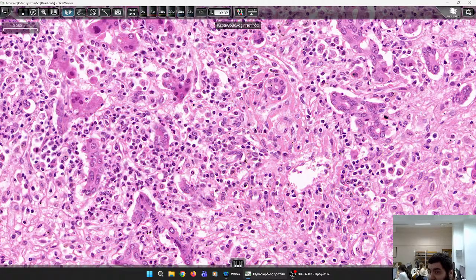What causes this? The most common would be autoimmune hepatitis and acetaminophen toxicity. And some poisoning, you listen to the news, mushroom poisoning. Yes, toxic mushrooms.